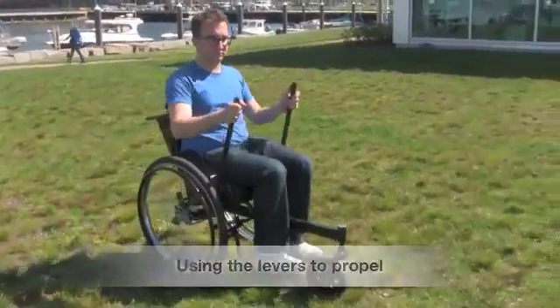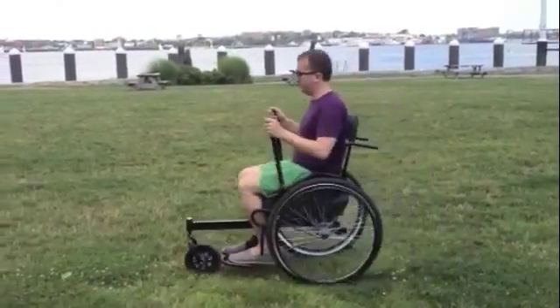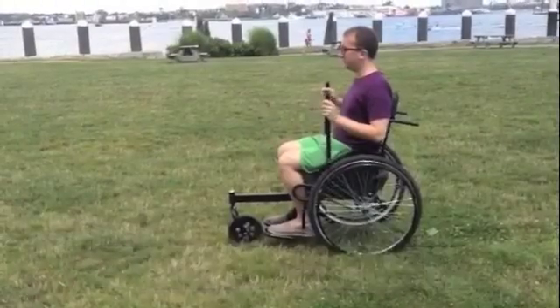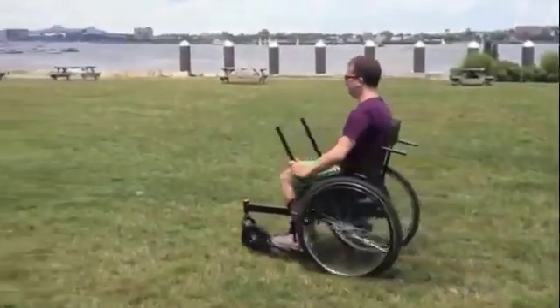Push the levers forward to propel the chair. When getting started on the LFC, it helps to have a little bit of practice to learn how to use the chair's features correctly. Do not push too quickly on the levers, as this will cause the LFC to tip backwards. When learning to use the LFC, push forward in a gentle, even manner, ensuring that the front wheel does not move upwards.